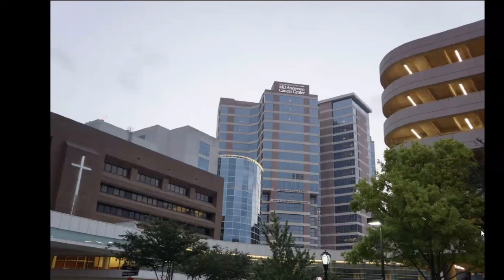I do a first pull through on the right side making sure that I didn't miss anything. And then just to kind of double check myself, I'll retroflex in the cecum right colon to make sure that there's nothing on the backs of the fold that I missed. And I do find diminutive lesions on the backs of the folds. So I think it's a good habit for me.